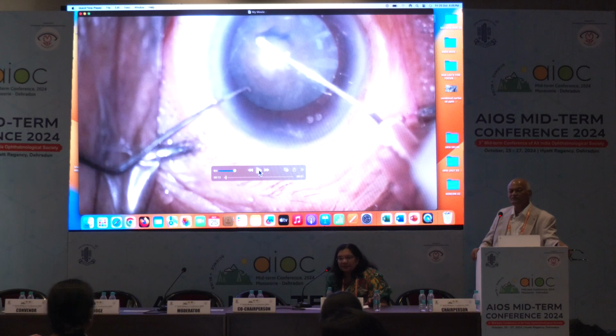Okay. Now the other thing is, I am gradually going to the different cases. We always feel that we should do hard cataract phacoemulsification. Yes, every type of cataract I can tackle and remove.